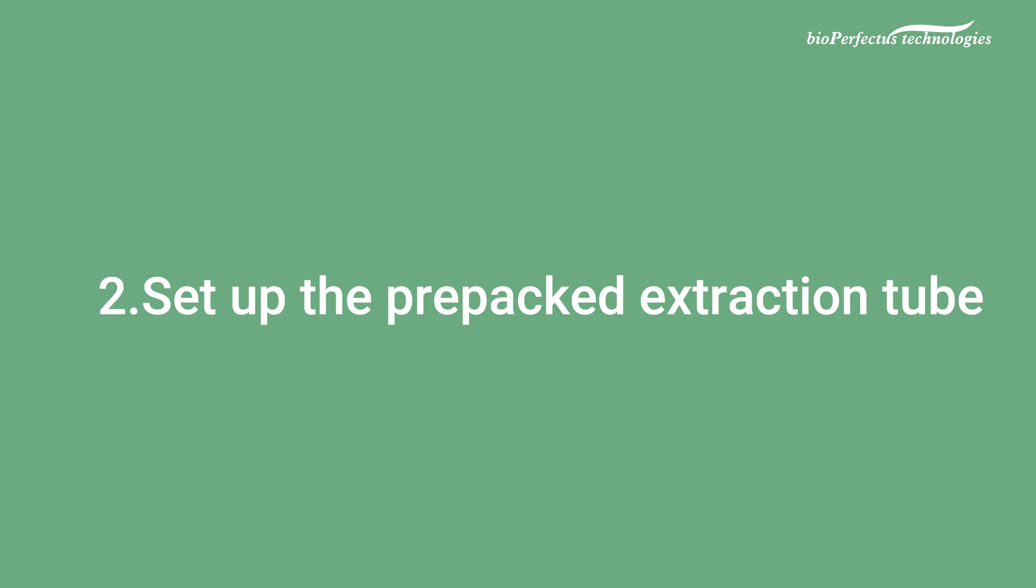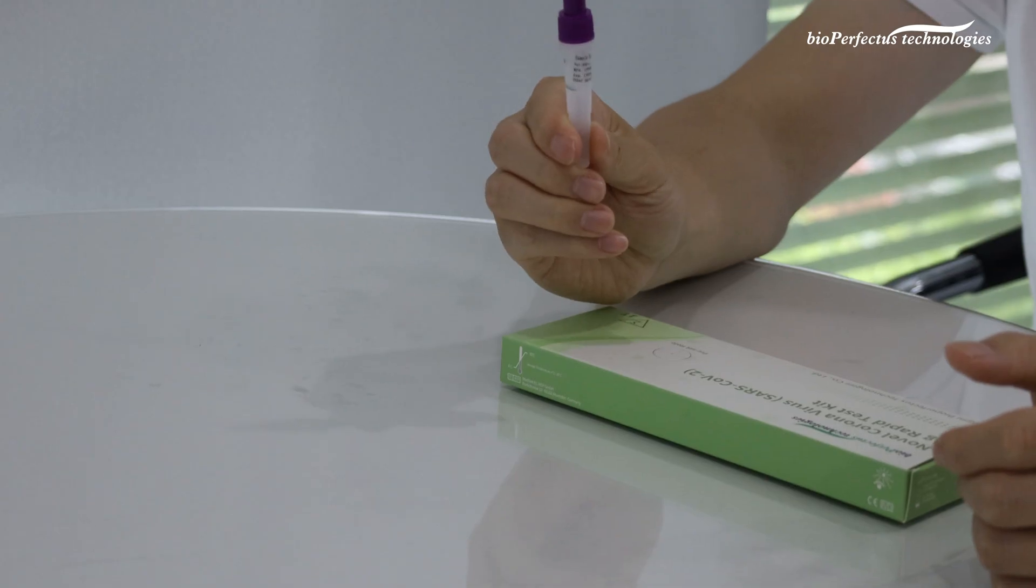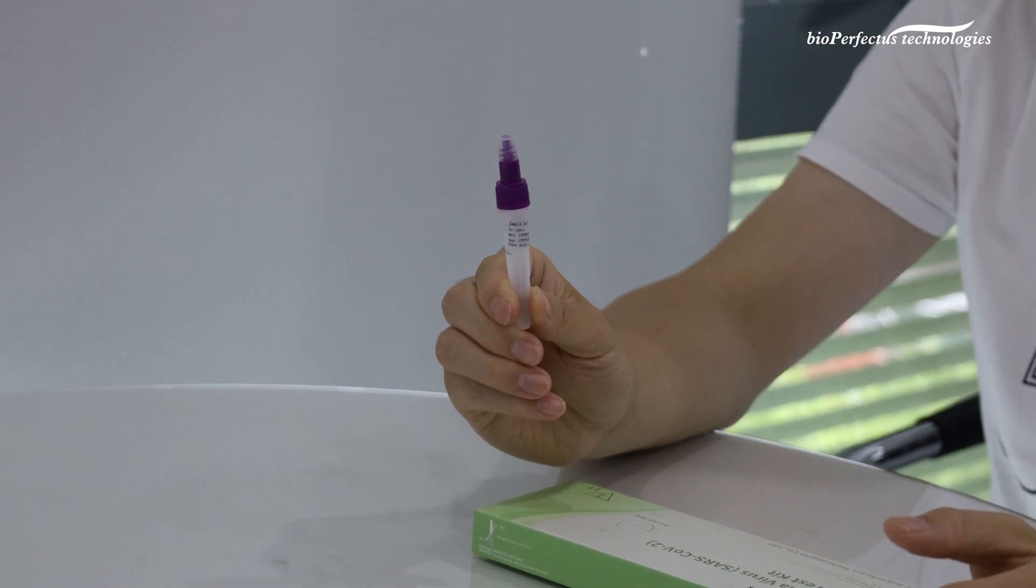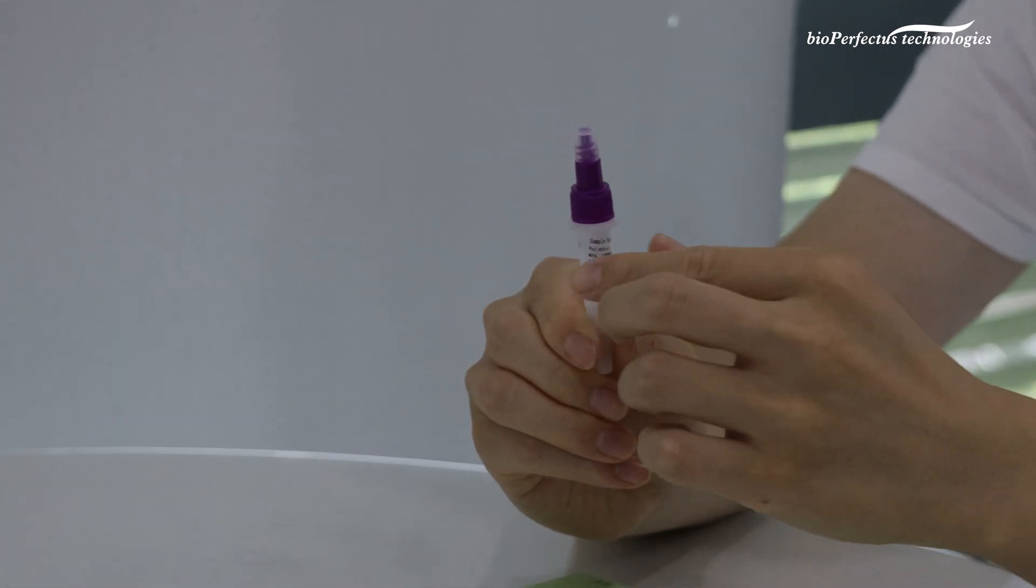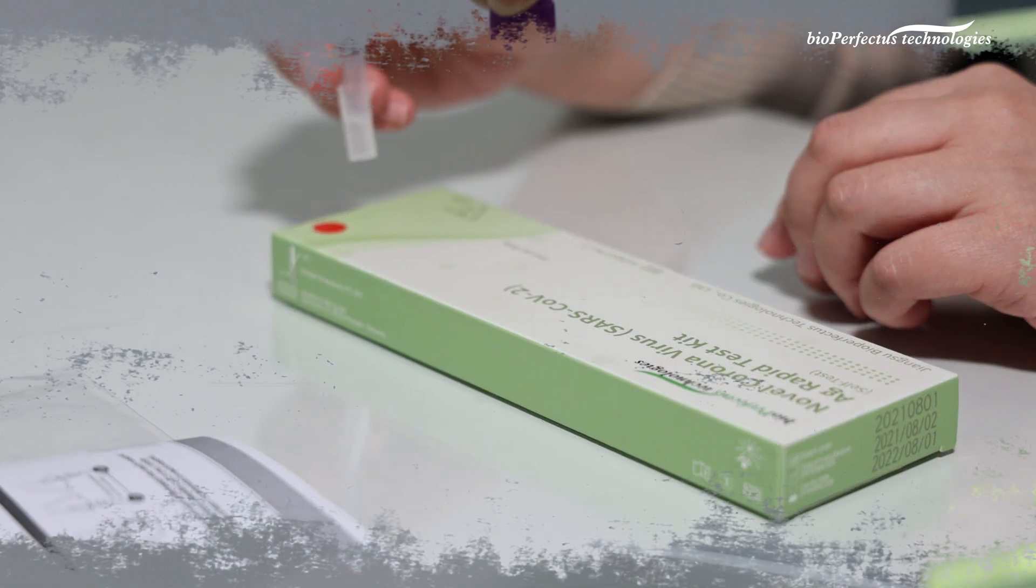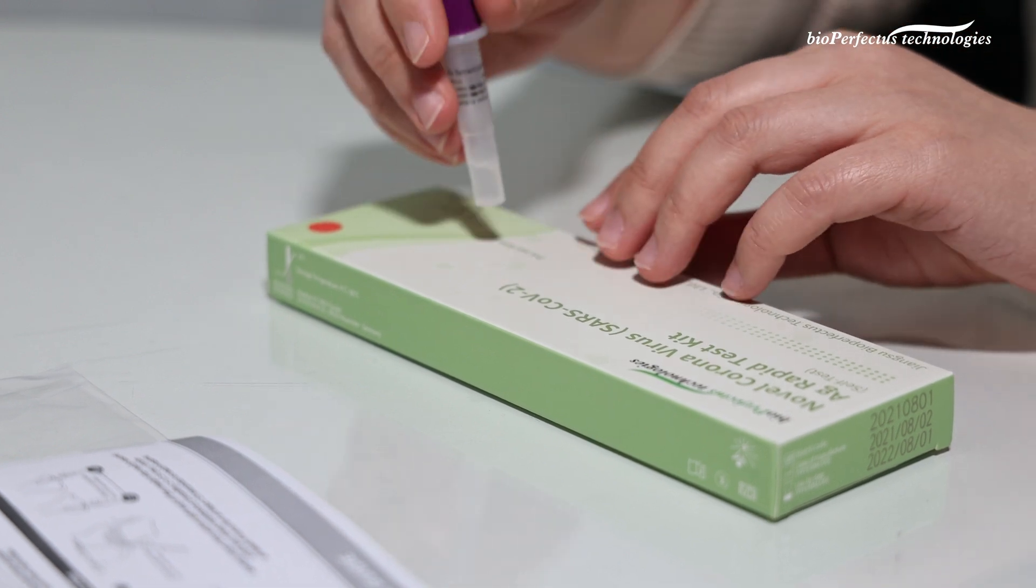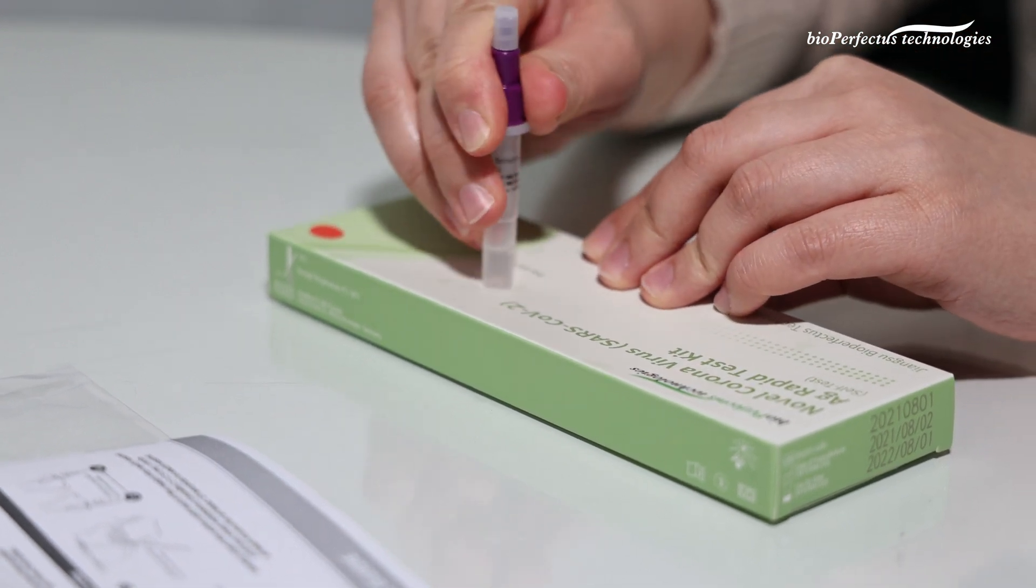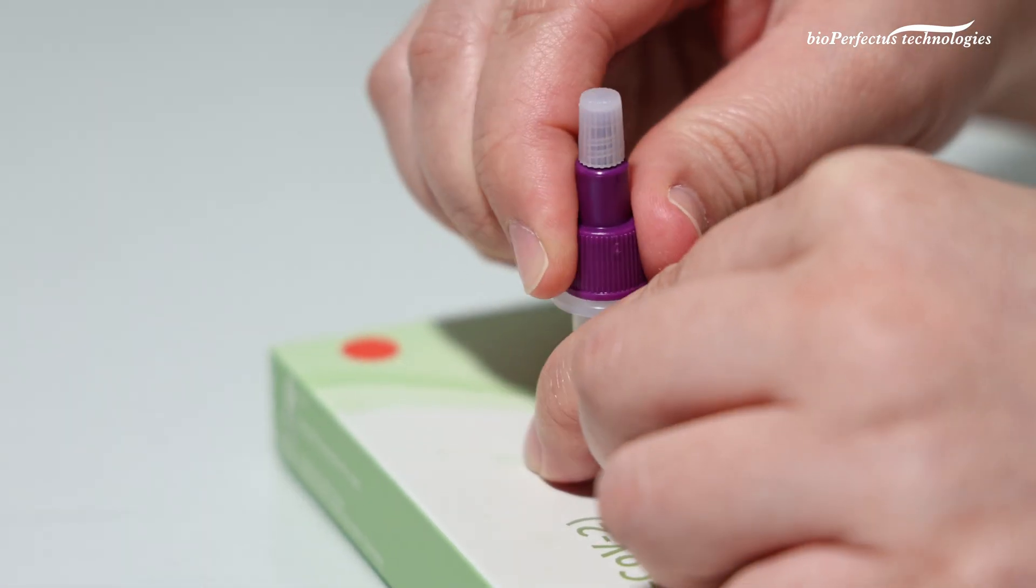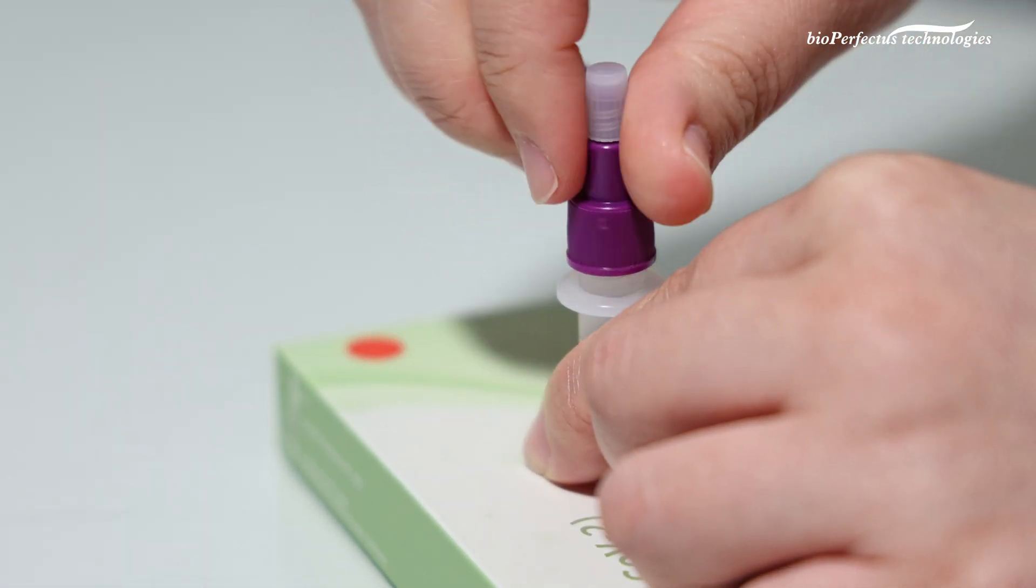Step 2: Set up the pre-packed extraction tube. Take the pre-packed tube out. Keep the pre-packed extraction tube head upwards, and shake the tube two to three times. Place the tube in the preset hole on the package. Unscrew the purple cap from the pre-packed tube.